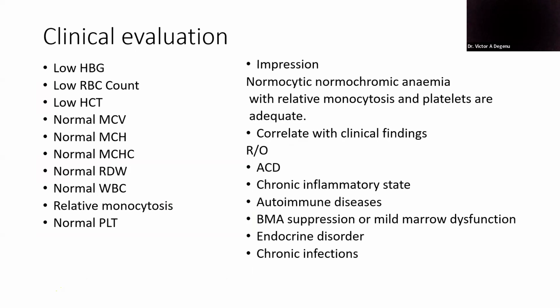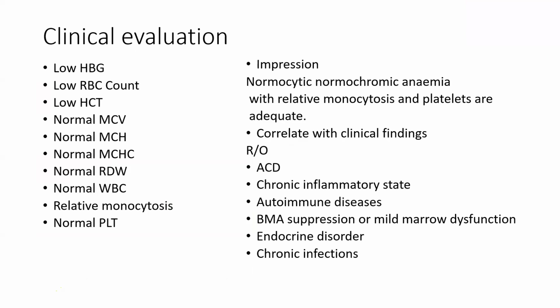So, clinical evaluation. We have low HB, low RBC count, low PCV.